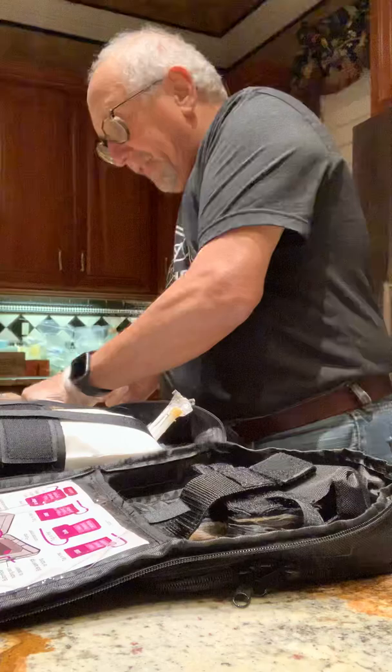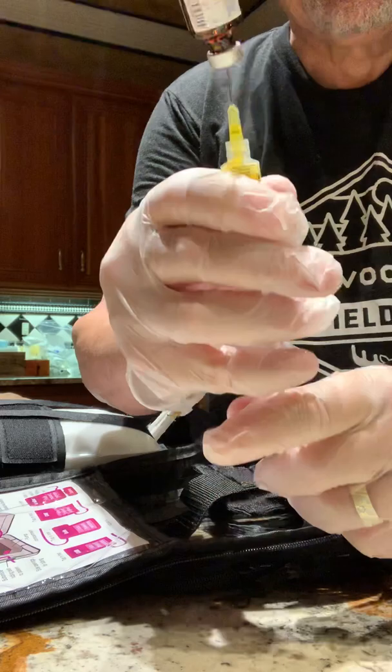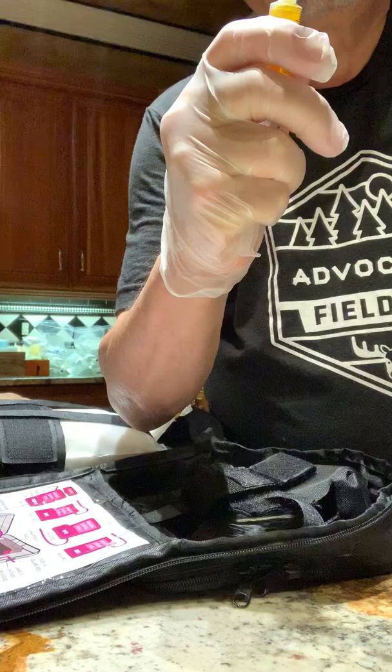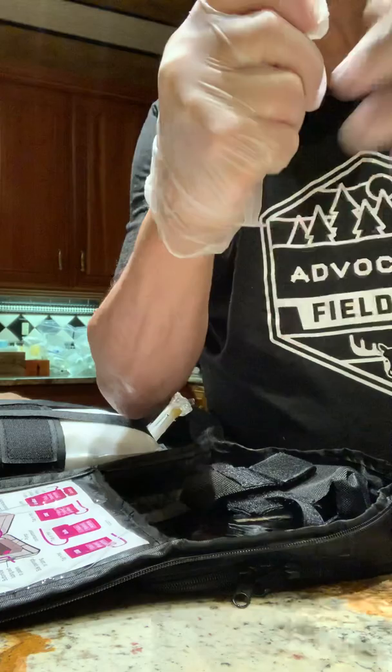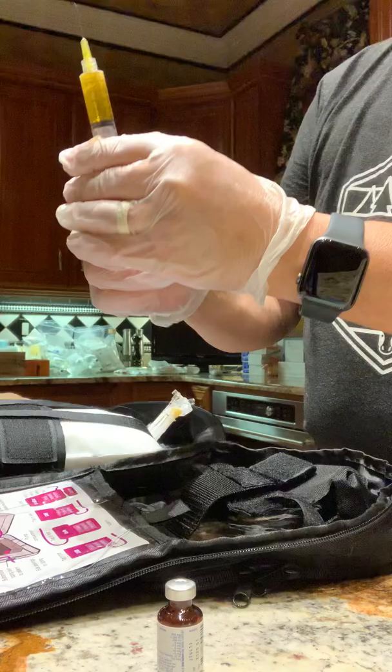Set that syringe aside, grab another syringe, give it a little twist to make sure the needle is on tight — I've learned the hard way you have to do that. Then draw down five milliliters out of this little vial, pull the needle down to make sure we get 100% of it and slide it off. Then push the air out. That is Part A of the multivitamin.